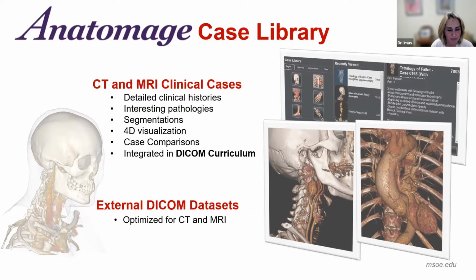A new feature that I find particularly helpful in my classes is the case comparisons feature, and I'll talk about that. But it essentially allows one to compare cases within the case library. Some of these case comparisons are already pre-made for you, so you can select some of those, or you can import some of your own.